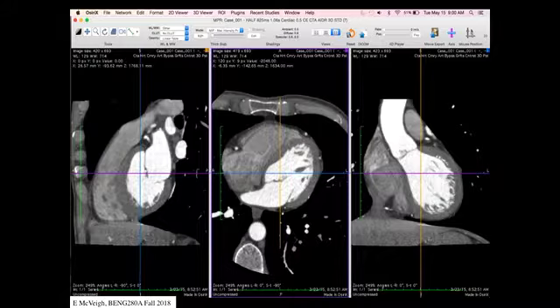But the great thing about three-dimensional data as opposed to just doing fluoroscopy where you're getting projections, the X-ray data, is that we can cut this three-dimensional volume into an infinite number of planes to take a look at things. So if we look at, say, so this is axial. So this blue line here is parallel to the floor.